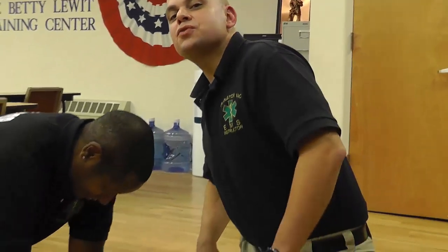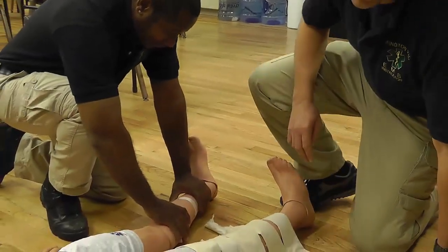All right, I'm ready to immobilize the leg. I took the liberty of checking the patient's distal perfusion and motor and sensory response, which are all intact presently. Now, I'm going to take my cravats and position them under the patient's leg, using the natural voids in the patient's leg to accomplish this.